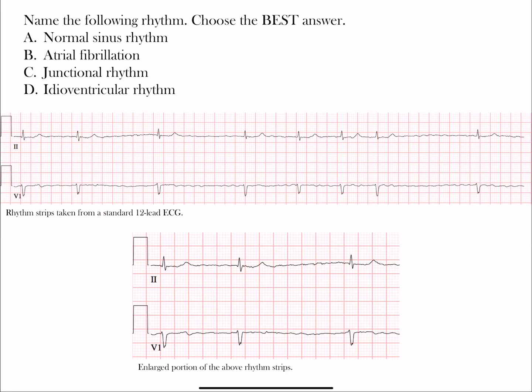Here we have our next rhythm challenge. Name the following rhythm and choose the best of these four option choices: choice A, normal sinus rhythm; B, atrial fibrillation; C, junctional rhythm; D, idioventricular rhythm. Four different rhythms — let's choose the best one.